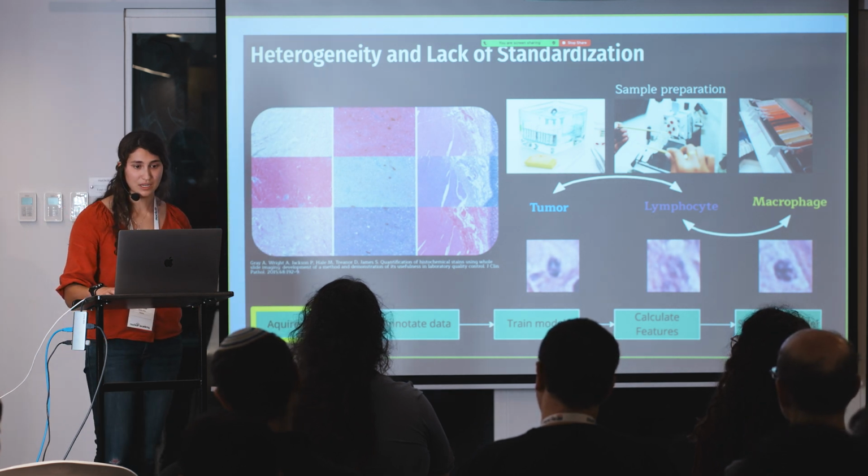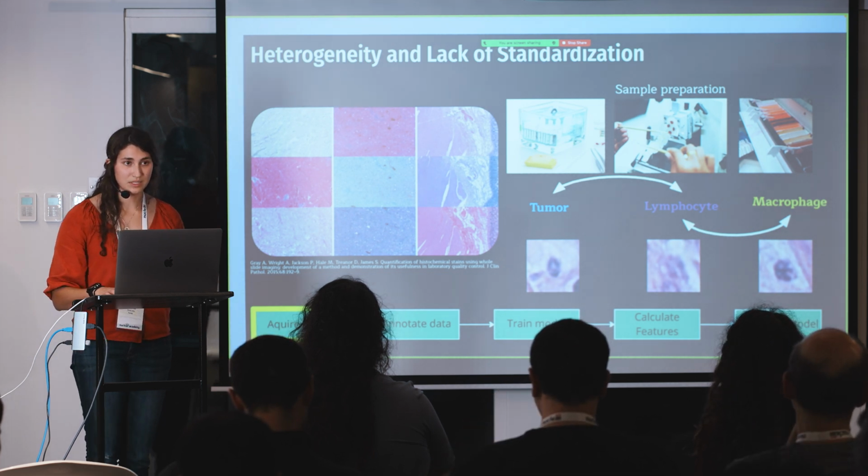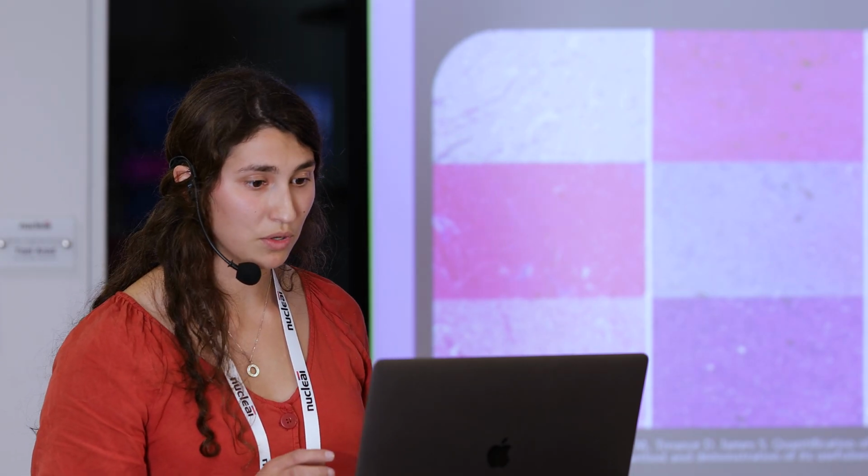And the problem here is that the differences in staining and the differences in our image can cause different classes to be confused. For example, a dark stain might make all stromal cells look like lymphocytes, when in reality there are several different subgroups. There's lymphocytes, fibroblasts, etc.